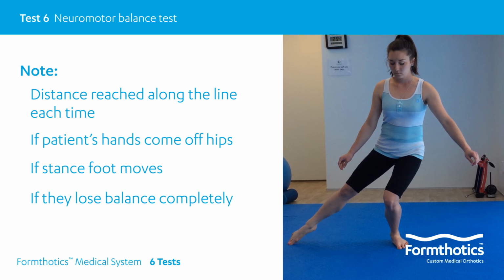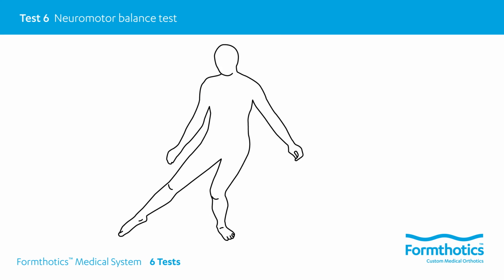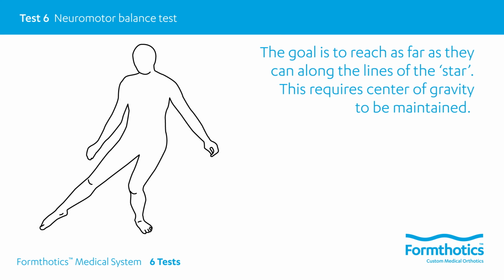It is a good idea for the patient to have a couple of practice runs before recording the results, and repeat tests can be done. The goal for the patient is to reach as far as they can along the lines of the star. This requires the center of gravity to be maintained.